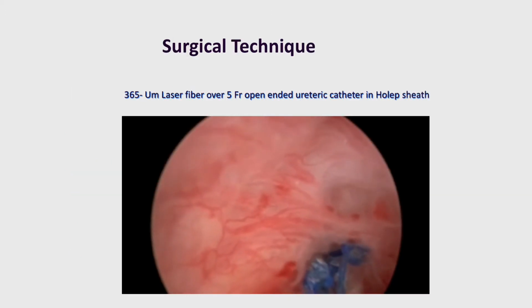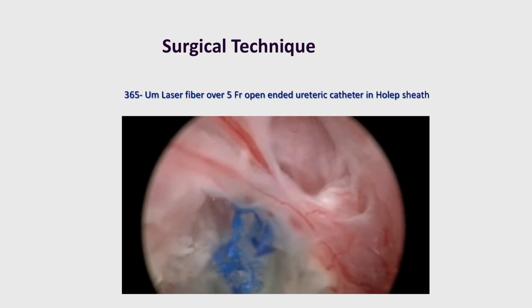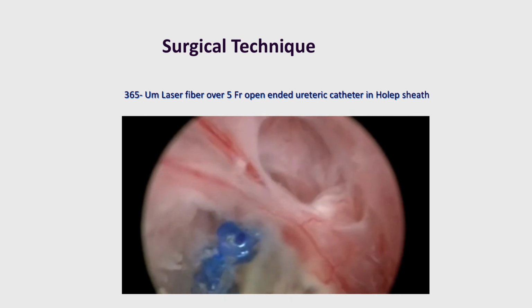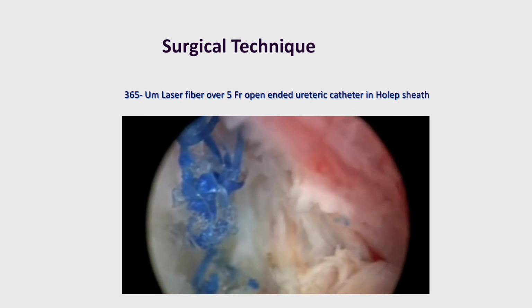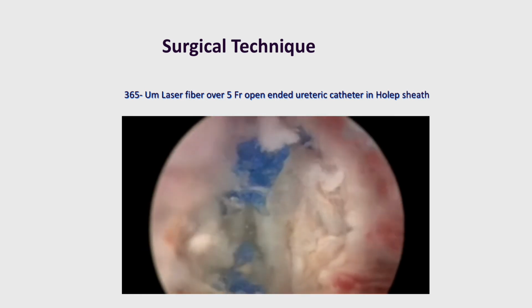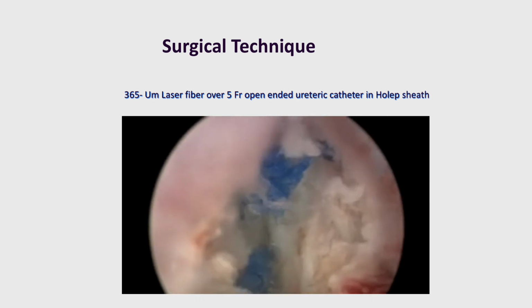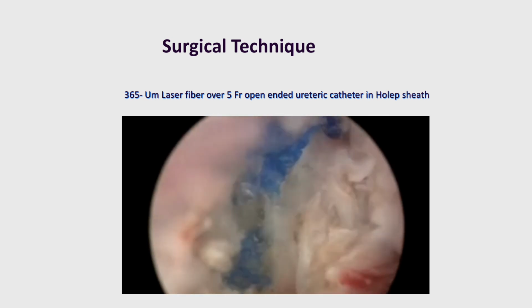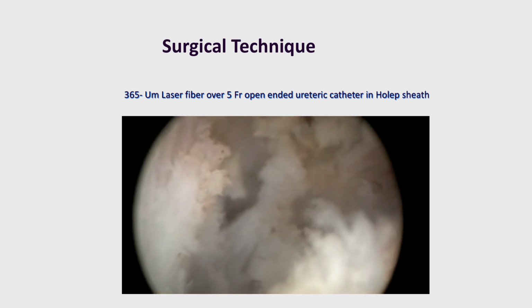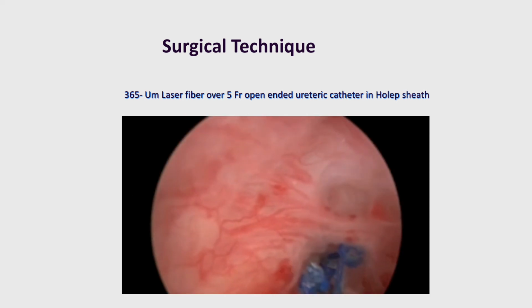Using holmium settings of 1.2 joules and 10 Hz, the mesh fibers were melted until they retracted into the periurethral musculature. At these settings, this particular mesh exposure took 18 minutes to completely melt. Although early in our experience, we report 3 cases using the holmium laser for excision of eroded mesh in the lower urinary tract. Despite the feasibility of this procedure, we feel that it should be reserved for surgeons and institutions that are dealing with a high volume of mesh complications. This technique should be considered by reconstructive surgeons in their armamentarium along with open or vaginal approaches.